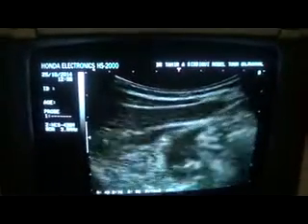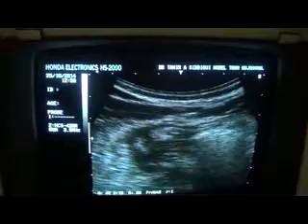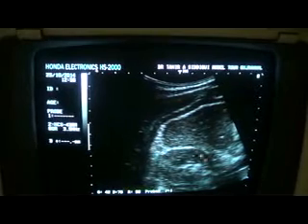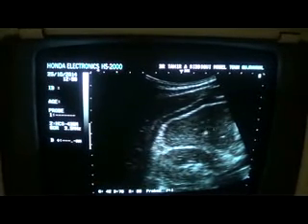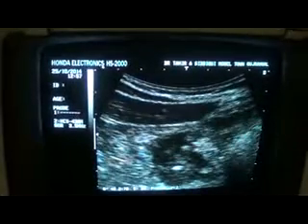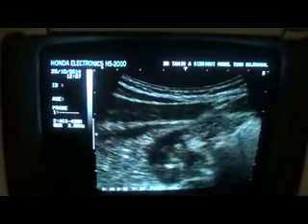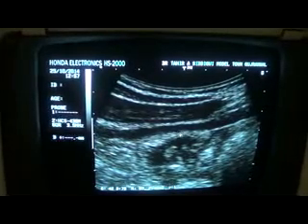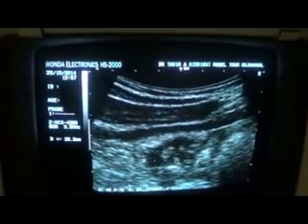I am in the subcostal region, and just when I move the probe straight downwards, I come across this area that appears to be kidney-shaped — but in fact it is not the kidney. The true kidney is this one, shown here in transverse section, and this is the liver. When I move the probe downwards, I see another uniform area with some air echoes in it. This is what we label as the pseudokidney sign at the region of the hepatic flexure of the ascending colon.